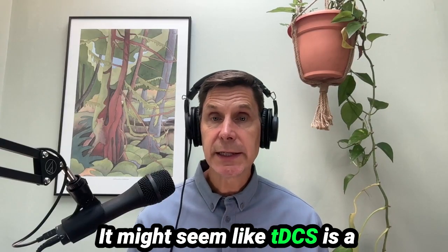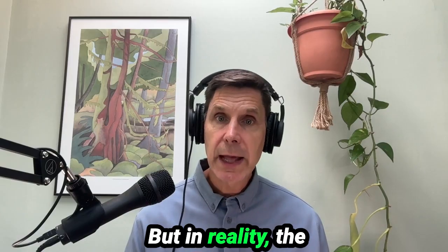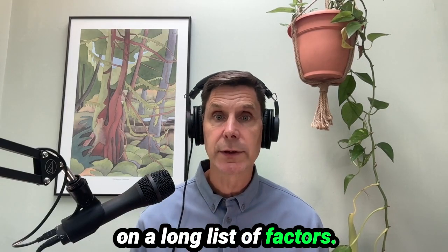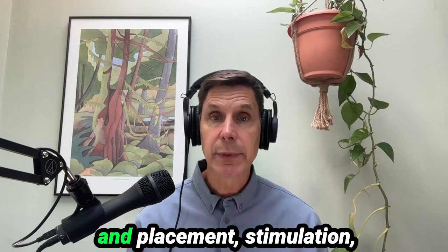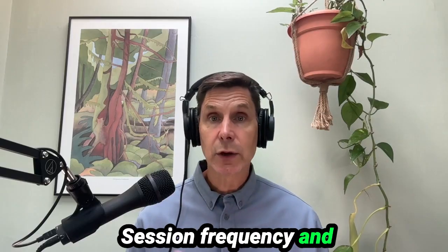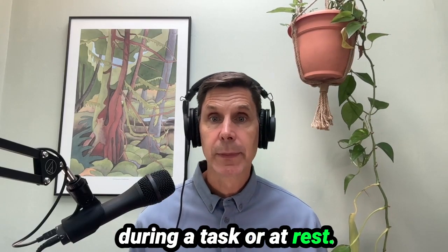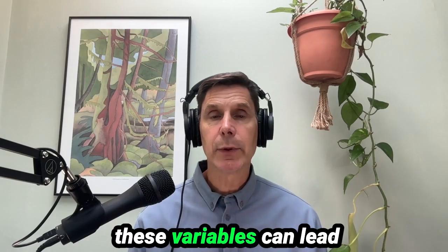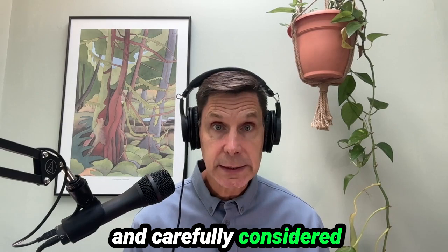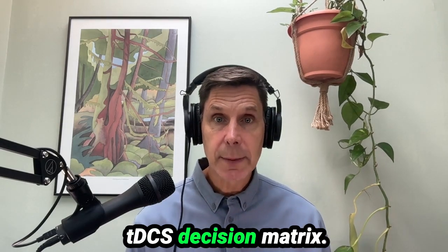It might seem like tDCS is a simple tool. 2 electrodes, low current, and go. But in reality, the effectiveness and replicability of tDCS depends on a long list of factors. Things like electrode size and placement, stimulation intensity and duration, session frequency and course duration, and whether stimulation is applied during a task or at rest. Even minor changes in these variables can lead to different outcomes, and that's why evidence-based and carefully considered protocol design is essential.